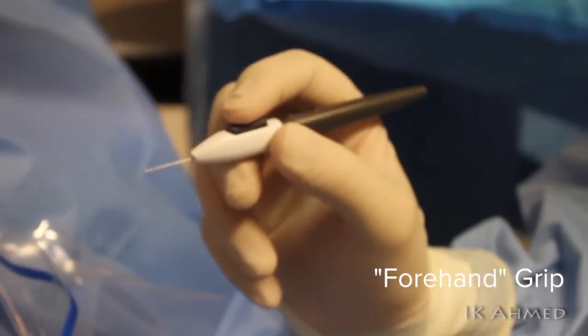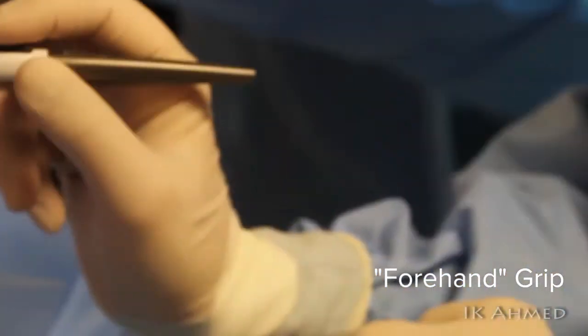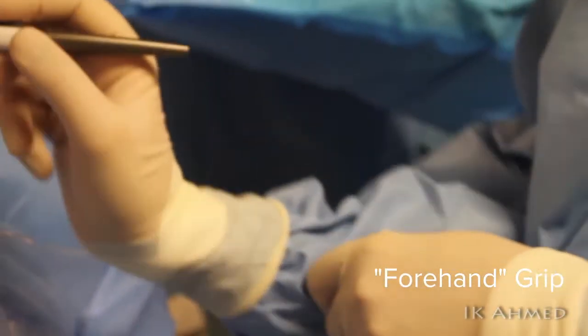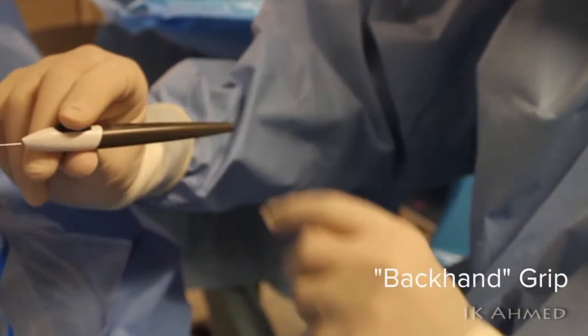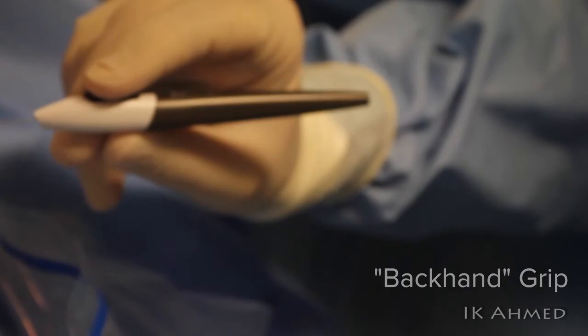If I turn my hand to a forehand position with our wrist extended, it is very hard and very awkward to rotate that hand in a clockwise fashion — we're locked at the elbow and the extended wrist makes it very difficult. On the other hand, if we rotate our hand to a backhand grip, we allow ourselves to rotate the wrist to follow the contour of the angle.